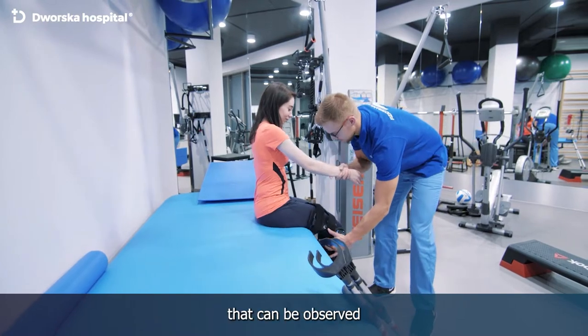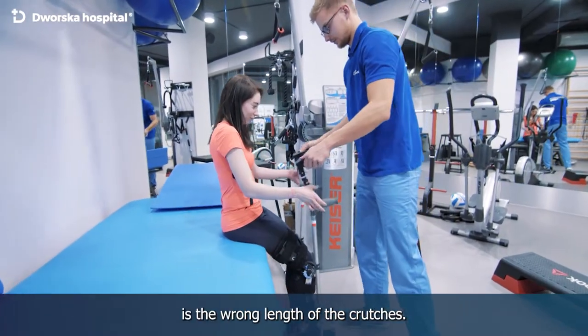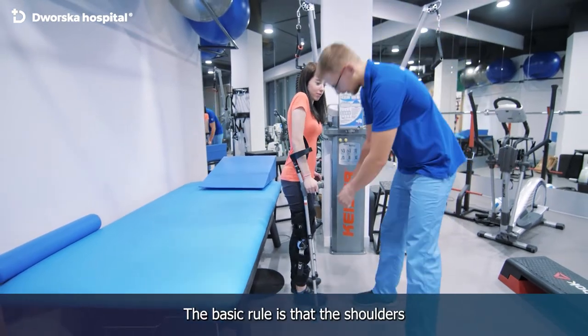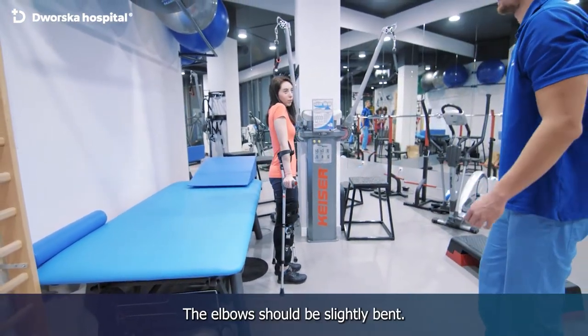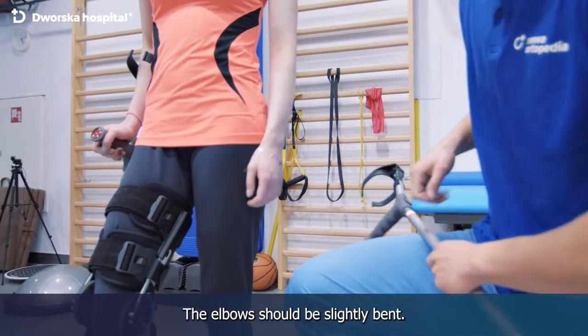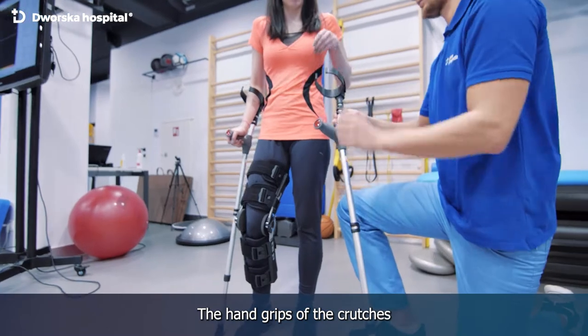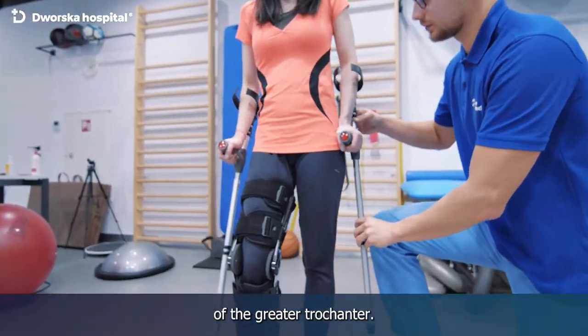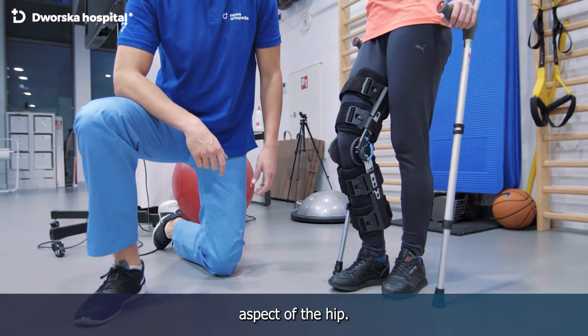The most common problem that can be observed in patients is the wrong length of the crutches. The basic rule is that the shoulders should not be raised but freely lowered. The elbows should be slightly bent. The hand grips of the crutches should be at the level of the greater trochanter — a bony spot on the lateral aspect of the hip.